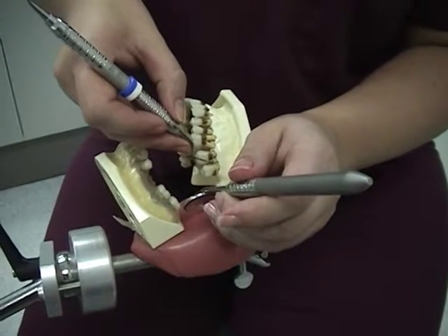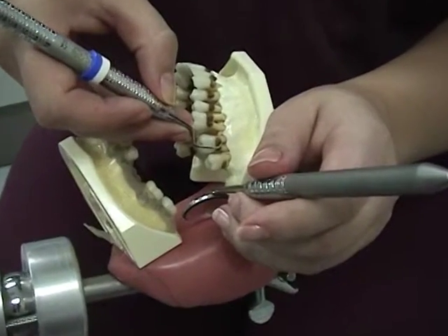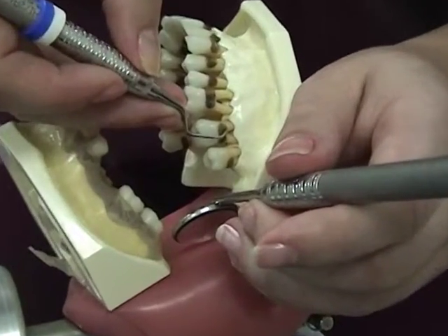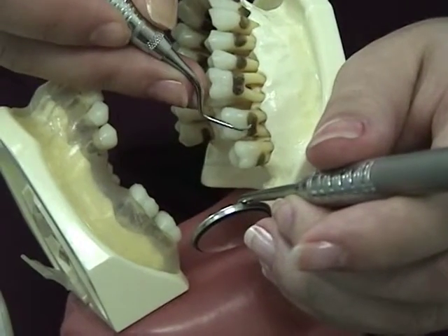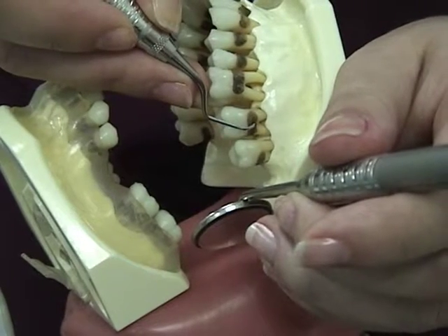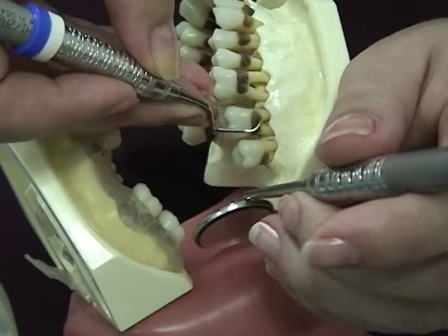For adaptation, confirm this is the correct end of the instrument and adapt the leading third of the working end to the tooth surface. For angulation, close the face of the blade upon insertion, as close to zero degrees as possible, and open the face for a working stroke.